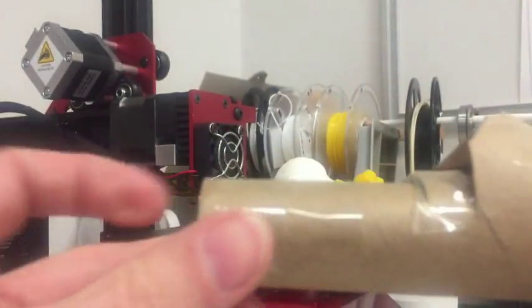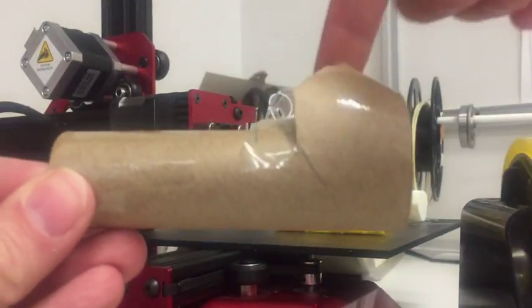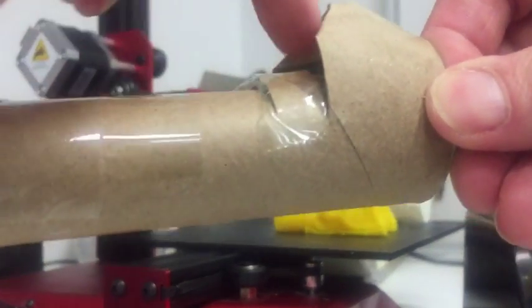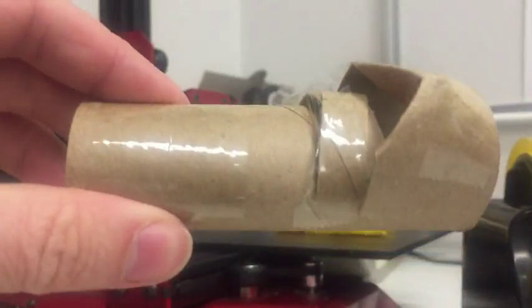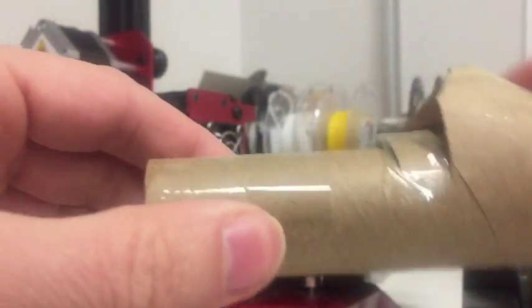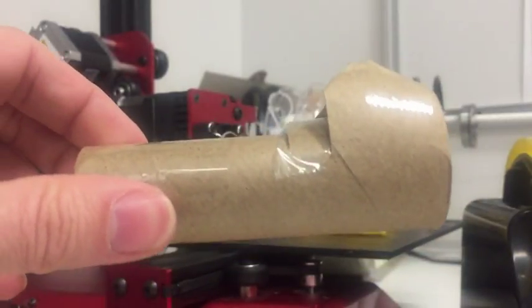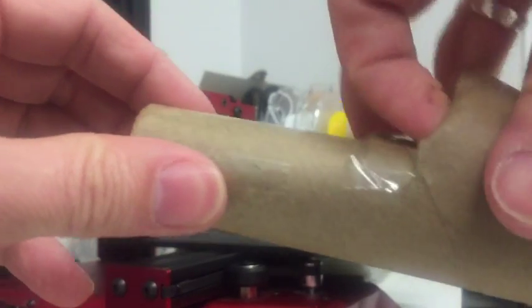And if you lie it on its side, again, you've got trachea, cricoid ring, thyroid cartilage with its prominence, so you can certainly feel up and you'll be able to get that cricothyroid membrane. Again, a bit of tape across the front like you did, put a bit of gauze over the top, and you've pretty much got your own. Do it in under a minute, make your own laryngeal cage to practice your emergency surgical airway.